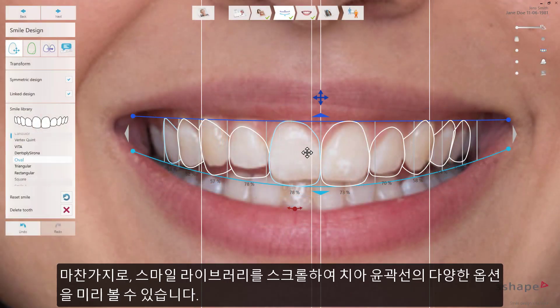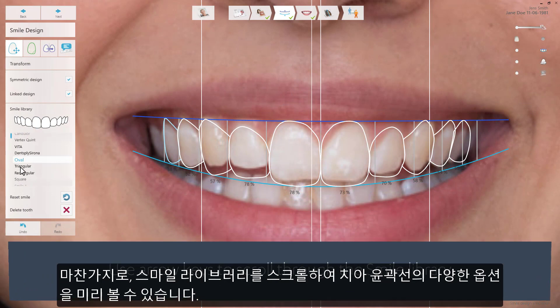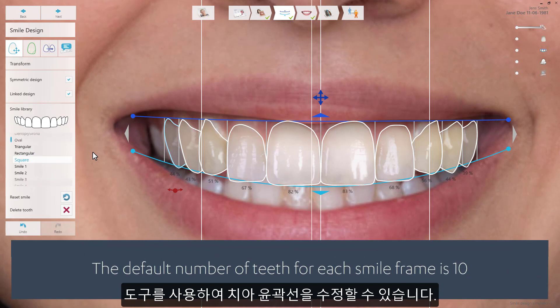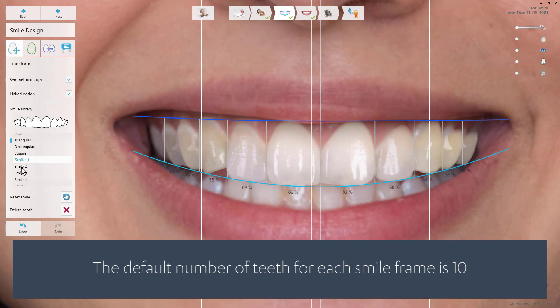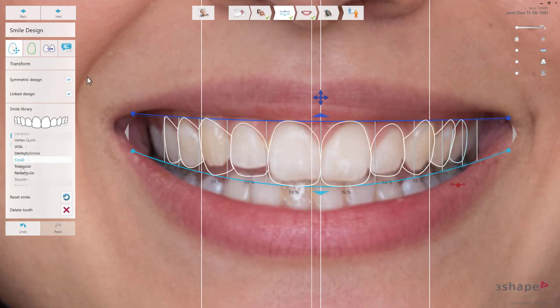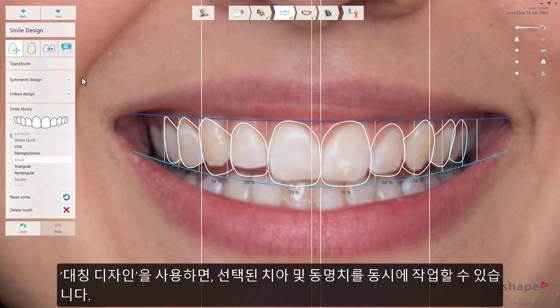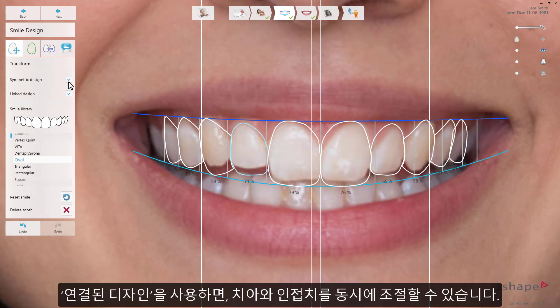You can scroll through and preview an extensive selection of smile outlines in the smile library, and modify these as well using the available tools. You can also use the symmetric design and linked design options to design the shape of any tooth in relation to the other teeth, both of which are activated by default. Symmetric design allows you to work on the chosen tooth and the contralateral tooth at the same time. Link design allows you to adjust the teeth and its neighbours at the same time.